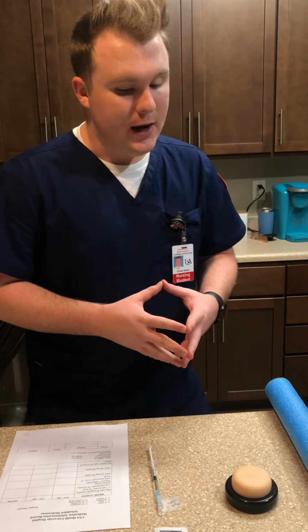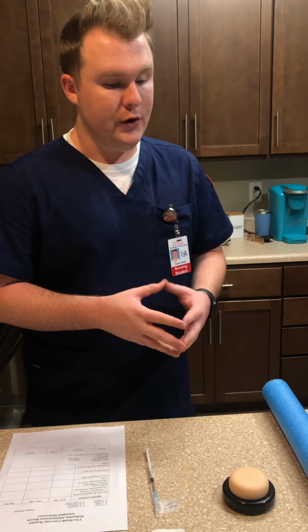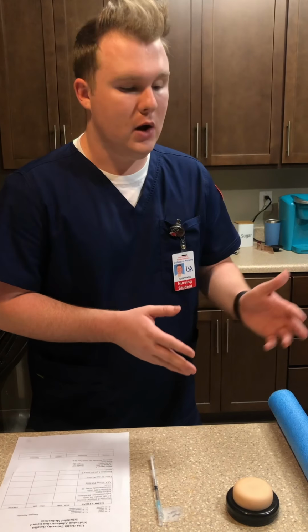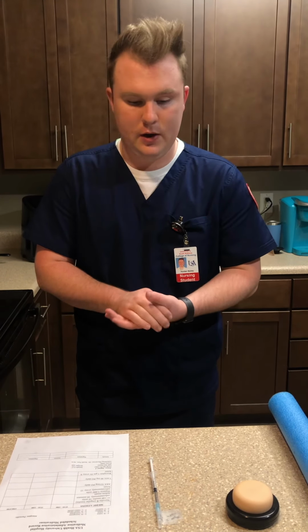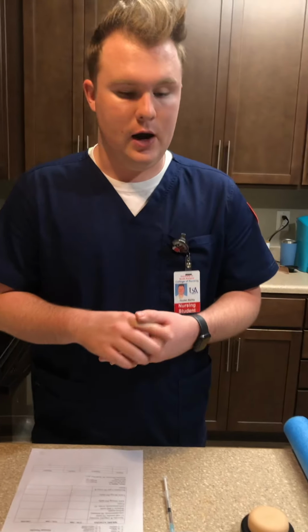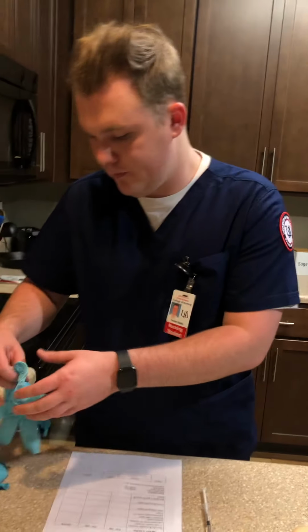Mr. Jones, today I'm going to be giving you your heparin shot, okay? And I'm going to be giving it in your abdomen. Do you have any questions? No? Okay, good. So now what I'm going to do is I am going to raise the bed up and I'm going to lower the side rail. Okay, so now what I'm going to do, after I do that, I'm going to don my clean gloves and my goggles.